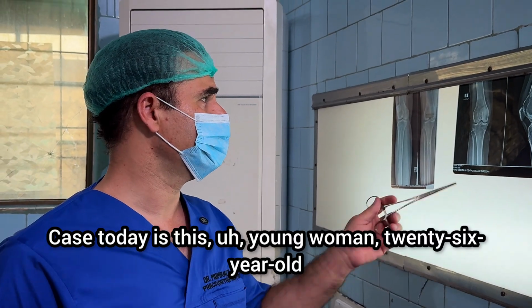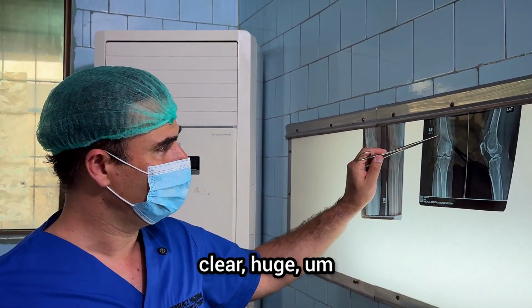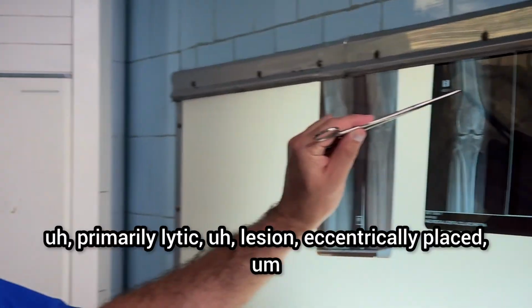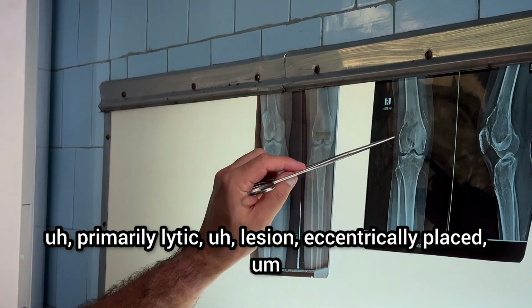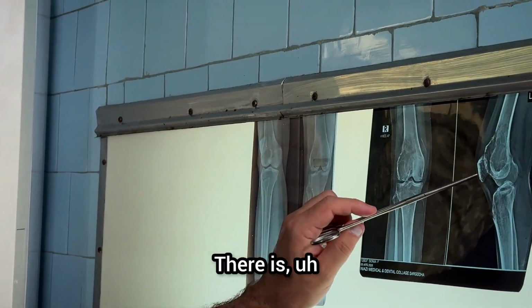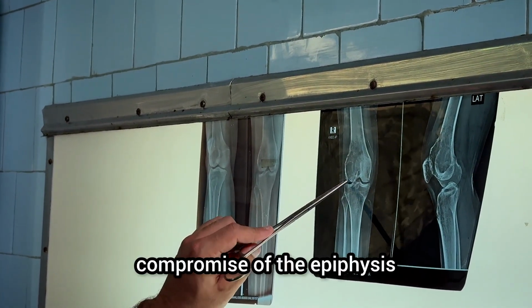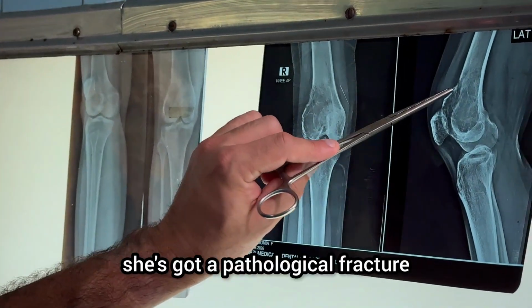Today is this young woman, 26-year-old. You see here a clear, huge, primarily lytic lesion, eccentrically placed over the metaphysis extending to the epiphysis. There is compromise of the epiphysis if you look at the MRI scans as well. And she's got a pathological fracture.